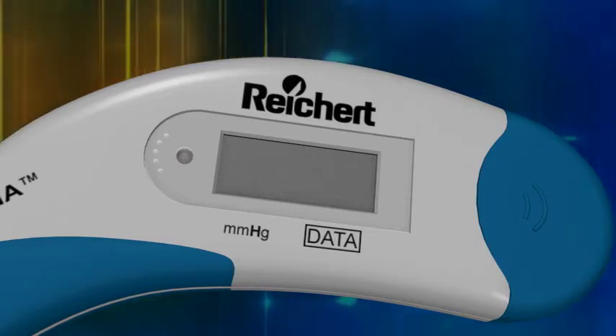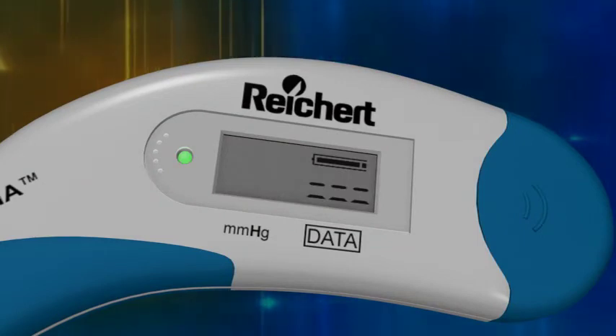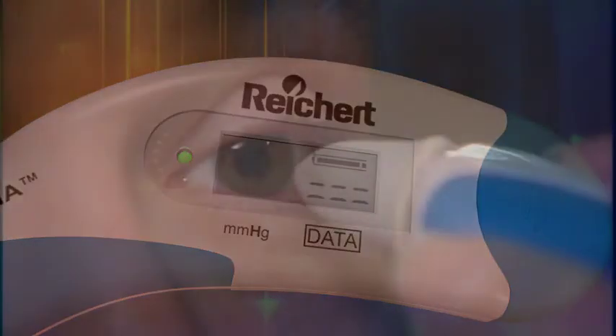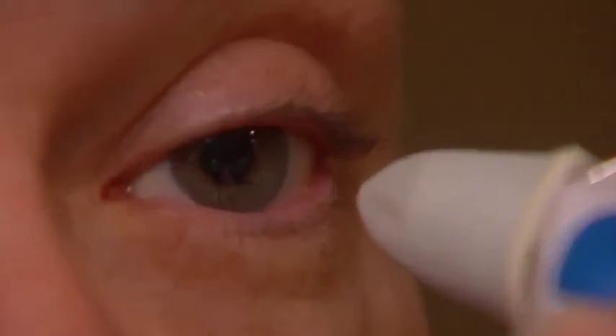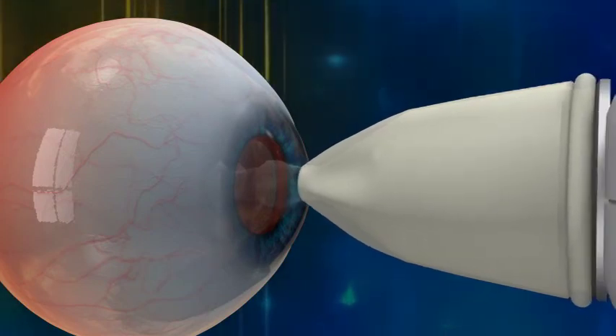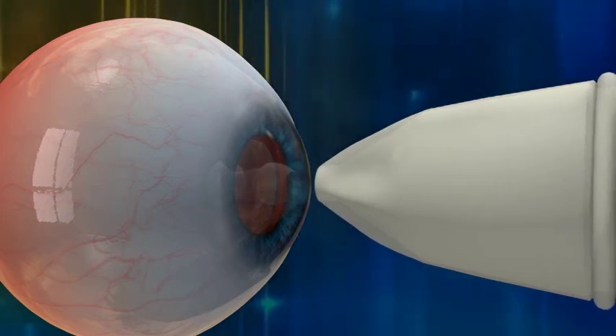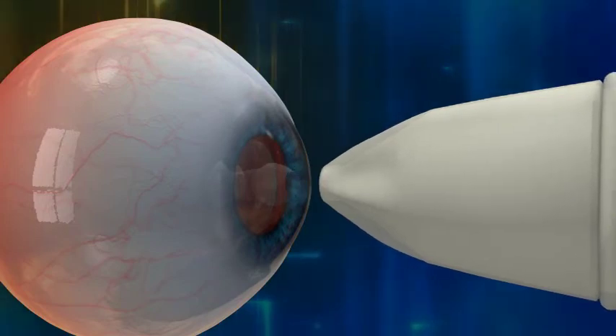After the double row of dashes is displayed, proceed with the IOP measurement. Gently applinate or tap the transducer on the patient's anesthetized cornea. Notice how the Tonopena Via tonometer is perpendicular to the cornea and the taps are light, quick touches. You will hear a click sound with each applanation.